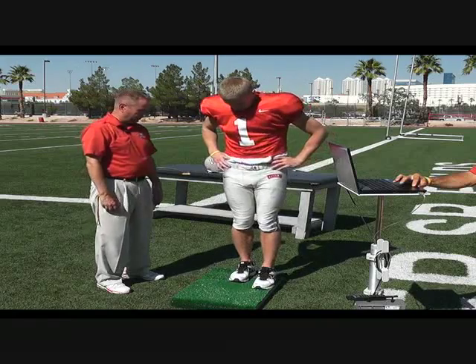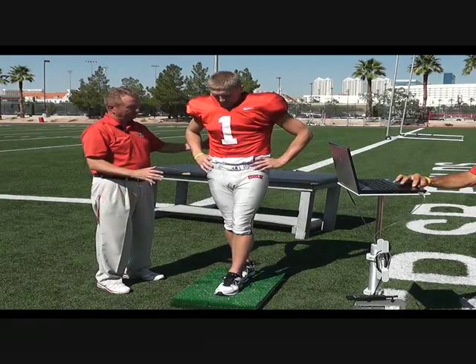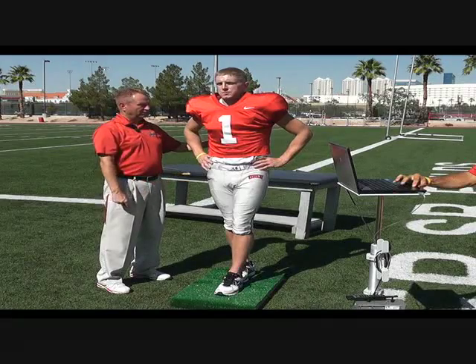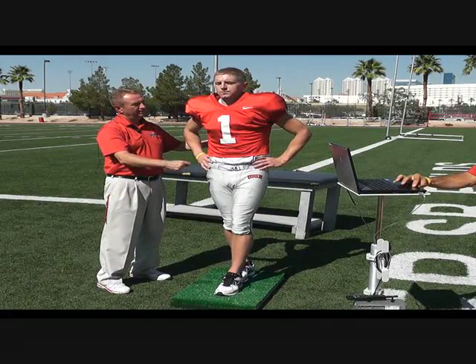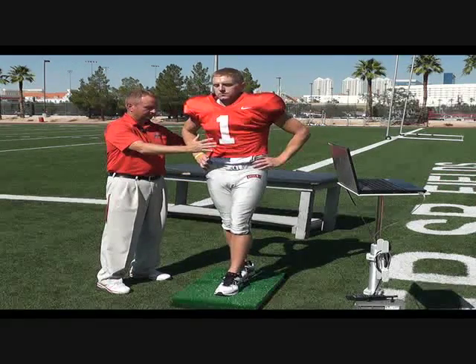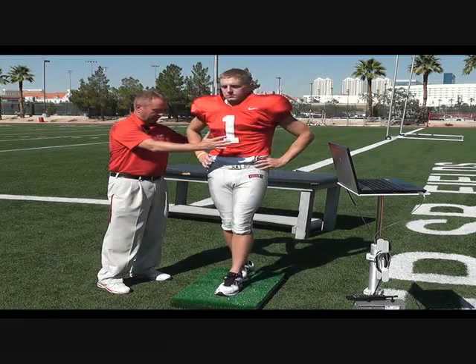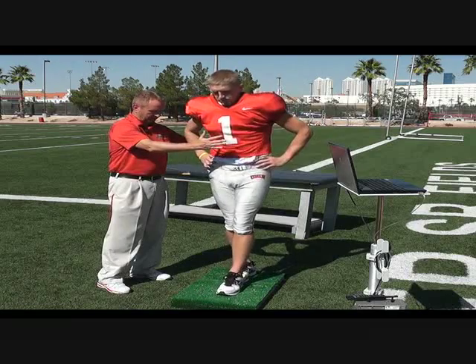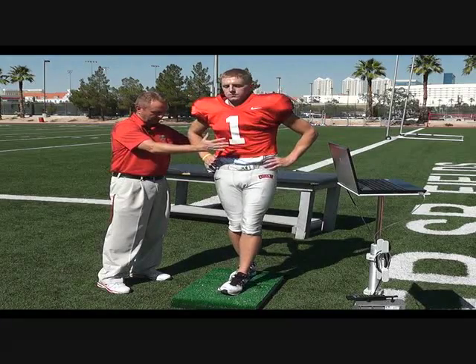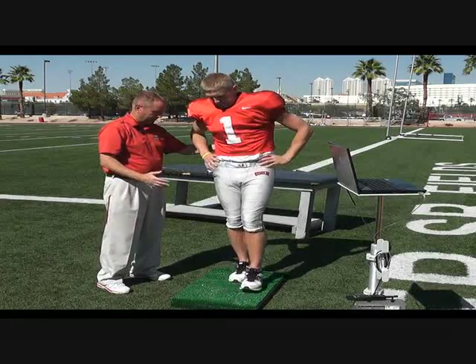A little wobbly. This one we're going to do tandem — heel to toe, front to back. Get a good base and have your hands on your hips. Your eyes will be closed for 20 seconds. Ready, begin. The computer is measuring any movement, changing the center of gravity. We're just here to hold them in case they would fall on the sideline. Done. Time. Open your eyes, you can step off.